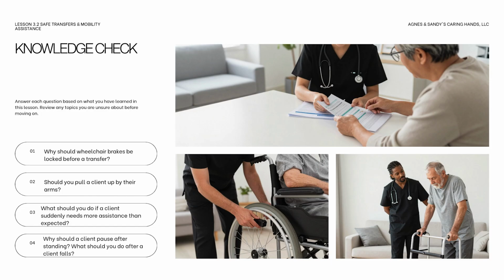Before completing the lesson, review these questions. Wheelchair brakes help prevent unexpected movement during transfers. Clients should not be pulled upward by their arms. If the client suddenly requires more assistance than usual, stop and report the change. After standing, clients should be given time to stabilize and checked for dizziness, weakness, or balance problems. Following a fall, remain with the client, follow emergency procedures, notify the appropriate personnel, and document the incident.